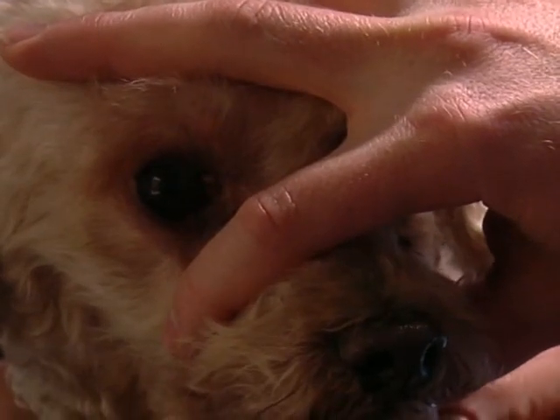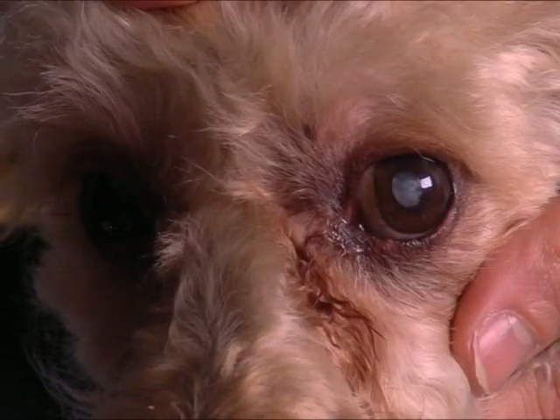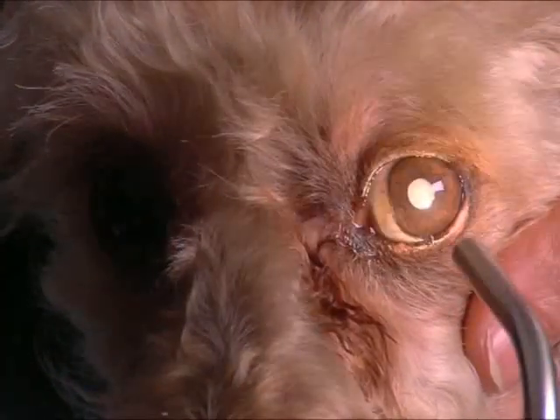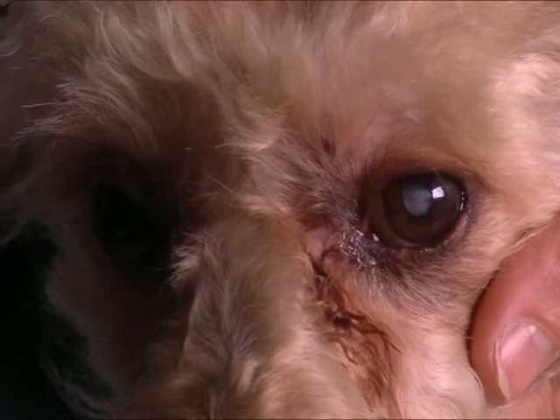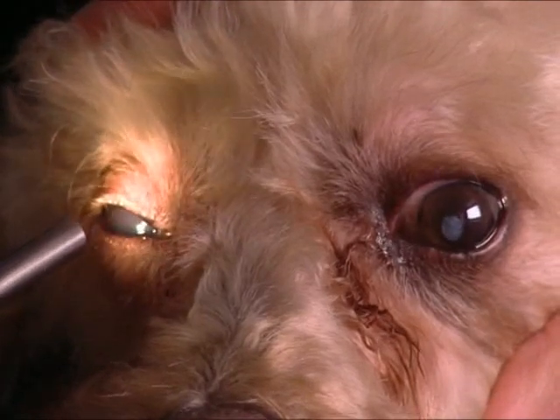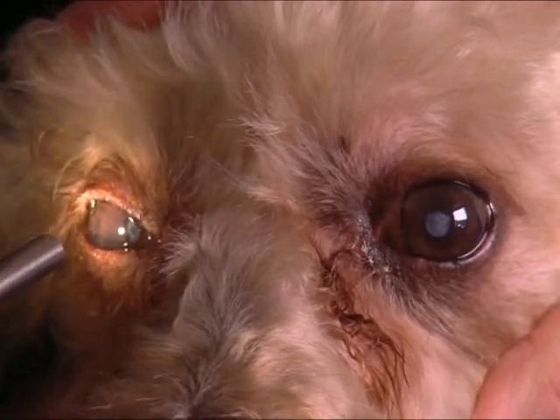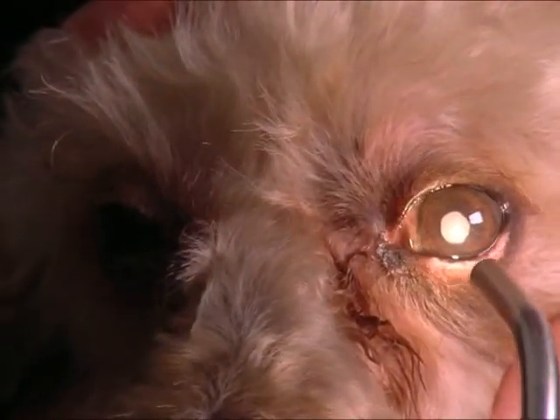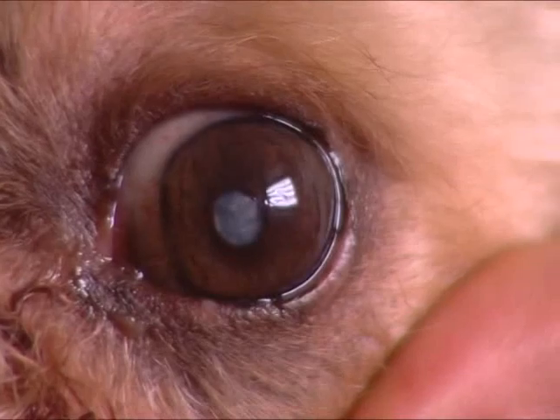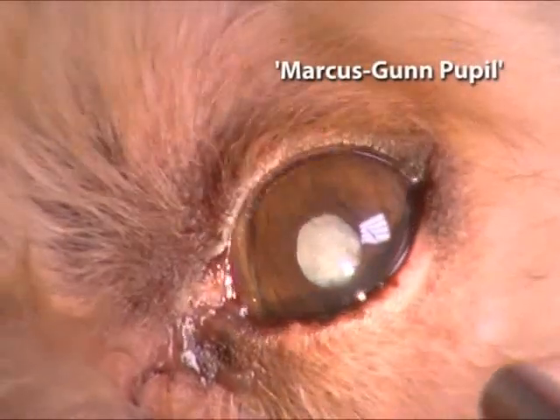In the right eye, the direct pupillary light reflex is normal. When the right eye is stimulated, the left pupil constricts at first, but when the light swings across, the pupil actually dilates. In other words, the left eye is able to respond to an indirect stimulus via the consensual response. However, it is unable to maintain the response under direct stimulation. Instead, the pupil dilates from its previously constricted position. This phenomenon, known as the Marcus Gunn pupil, is indicative of a unilateral afferent lesion.